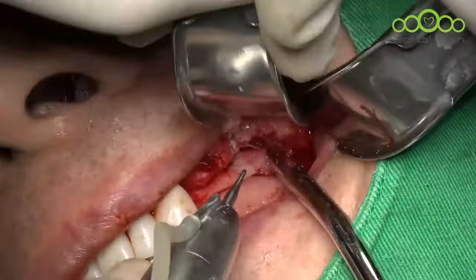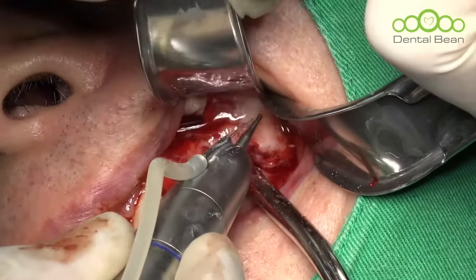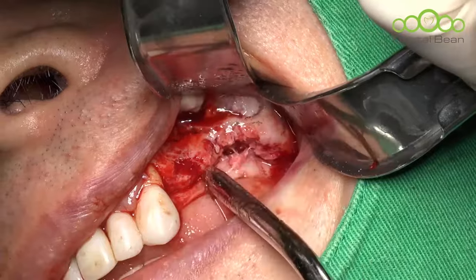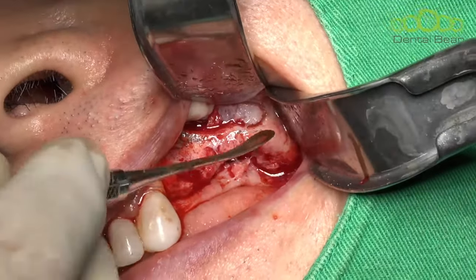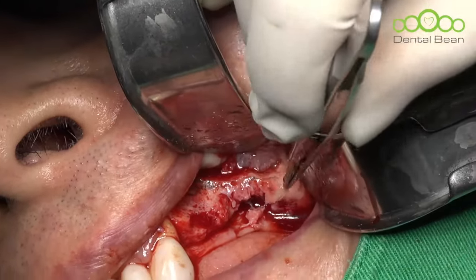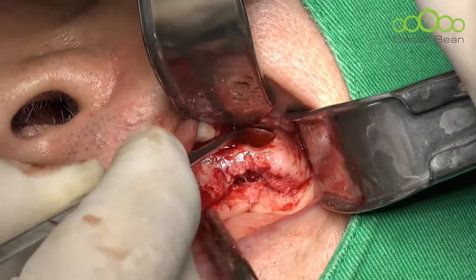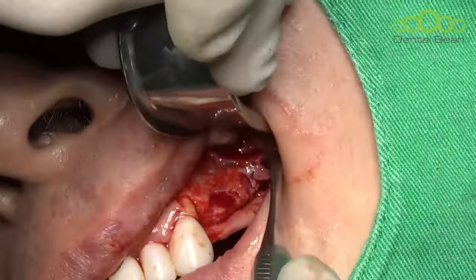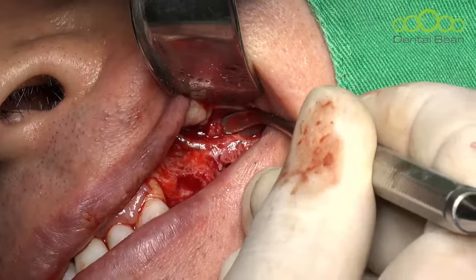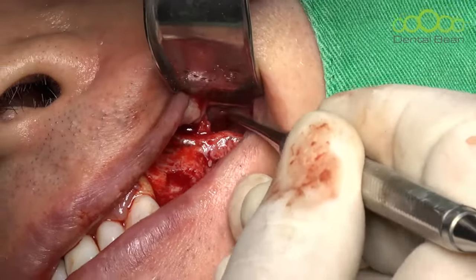Be careful. I'll enlarge the window distally. And then let's remove one window. Okay, sometimes I can see the membrane separation after the first trial of hydrolifting, but not in this case. So this case is not effectively separated. Okay, let's separate carefully. Always touch bone and separate the membrane.